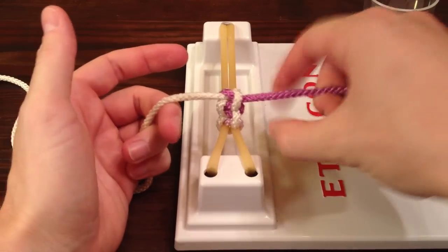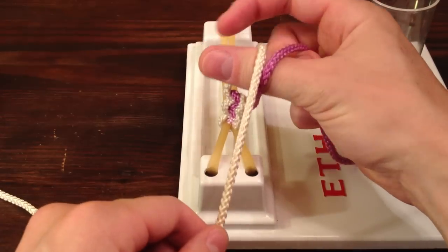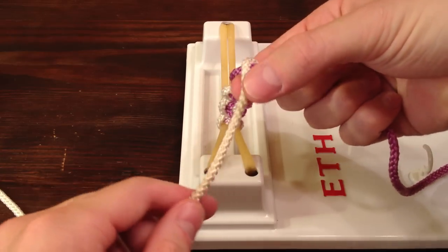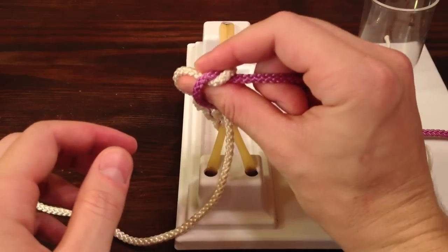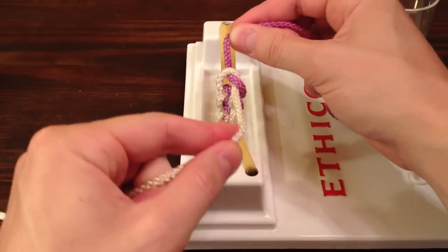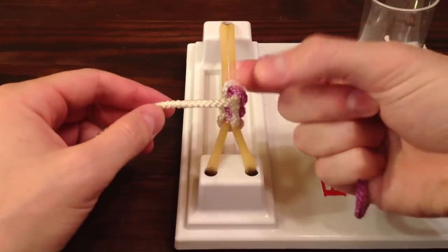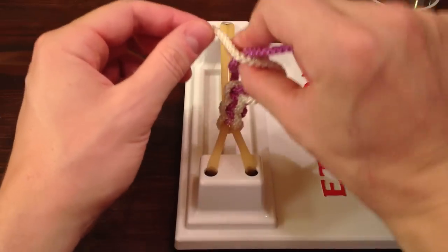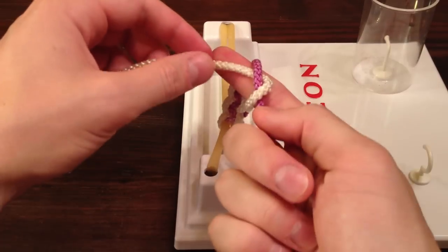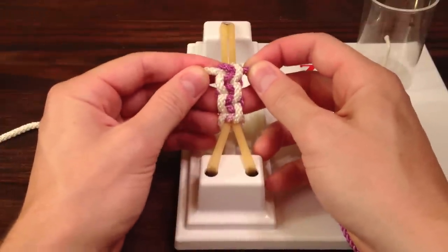Grab your strings with the pistol grip and form the ring. Again, rotate away from us, form your loop, rotate a second time towards you, grab the free end, and back a third time, pulling the free end through. We started with our thumb, so we're pulling the free end towards us. And for the final knot, rotate it towards you, rotate a second time, grab the free end a third time, pull the free end through, and tighten it by pulling the free end away from you. That gives you a third sweet square knot.